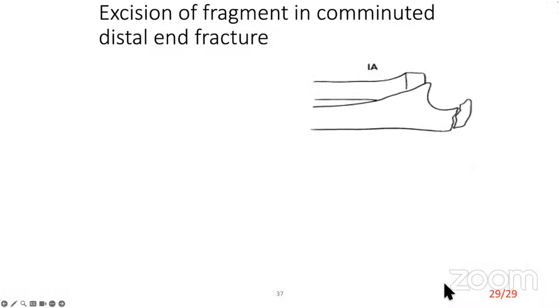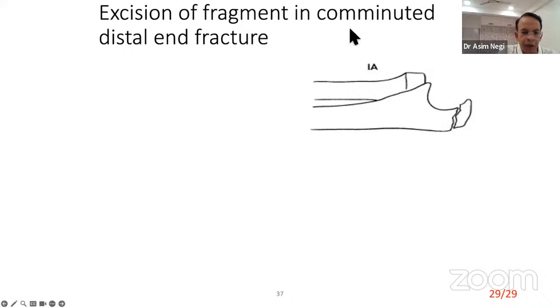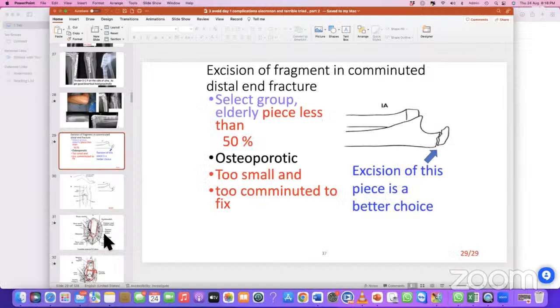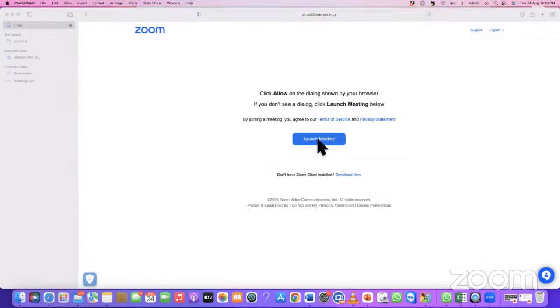Plus, when you are reconstructing this olecranon fossa, you can err on the side of slightly widening it. Either do a perfect reconstruction or it can be slightly widened, shallow. But it can't be narrowed. If you narrow it down, you will not get the range. So these two screws are most important. One is the one which is passing to the coronoid, and second is the kickstand screw that is going intramedullary from the first or second hole of the plate.